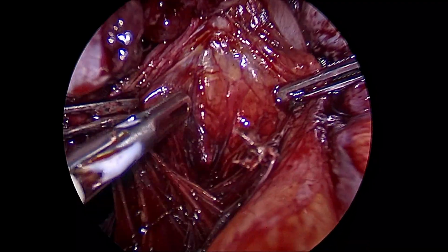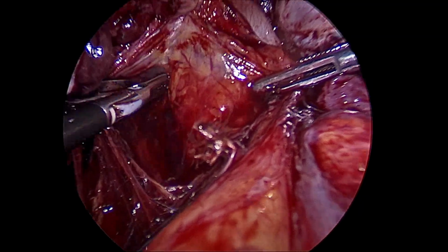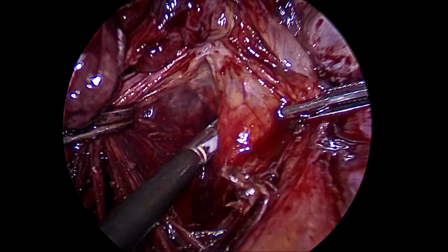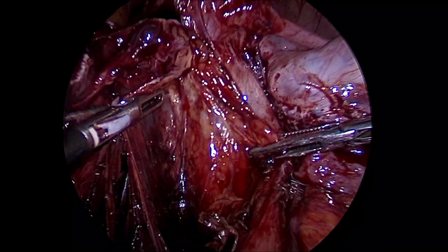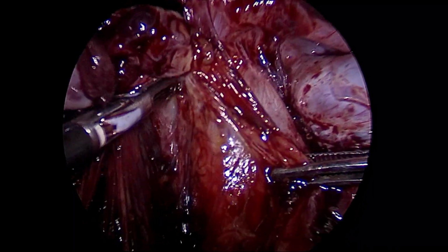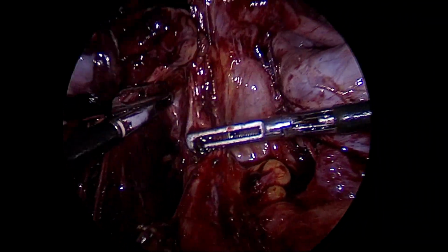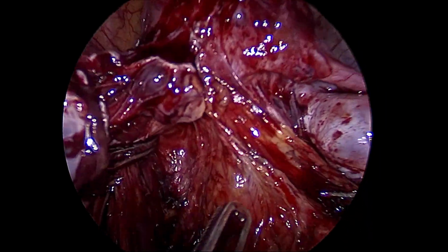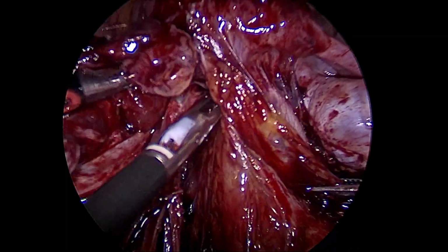It is again an avascular plane, provided we are in the right plane. Planes have to be understood, and we go right up to the POD in the left pararectal space. This will help to push the bowel medially and also create a space wherein the bowel will also go down, and these adhesions are again completely devoid of the bowel.